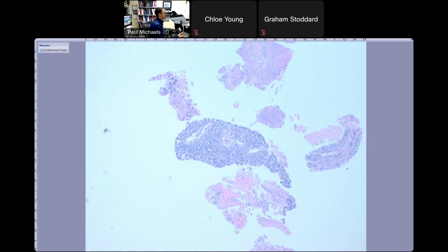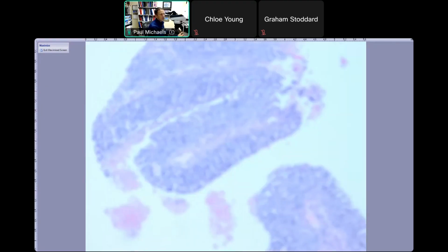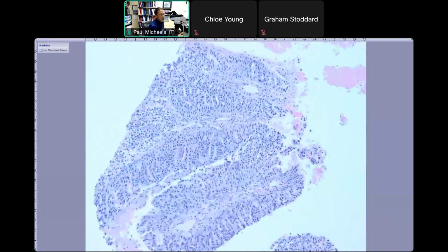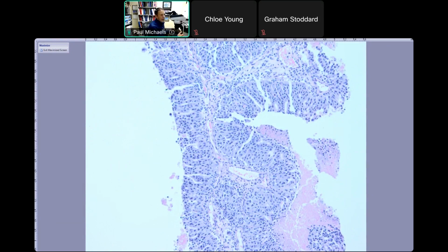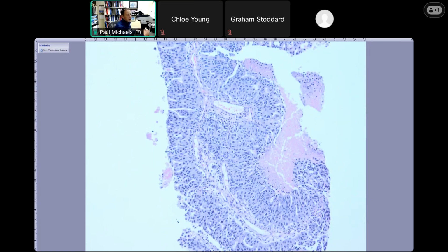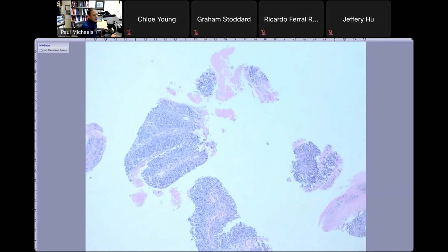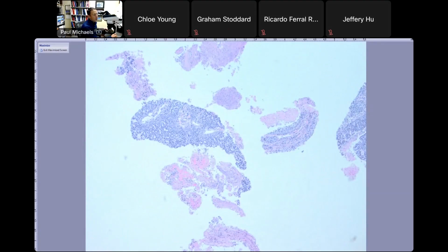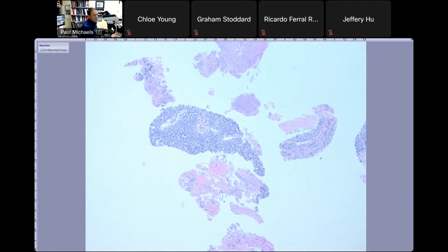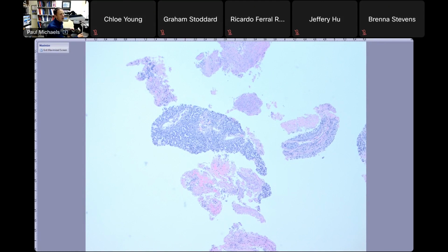So, adrenal gland, what's the most common tumor of the adrenal gland? Adenoma. Yeah, exactly. So when I get these cases, especially core biopsies where I'm dealing with a small amount of tissue, I go in with my pre-analytical opinion of what it should be, because a lot of times adenomas can look very different ways. And when I know that something is by far the most common tumor, I always think, okay, if I see something unusual, it's probably an unusual variant of the common tumor.